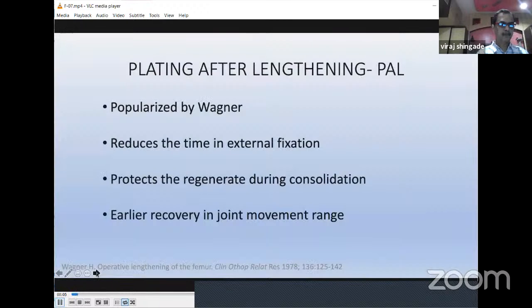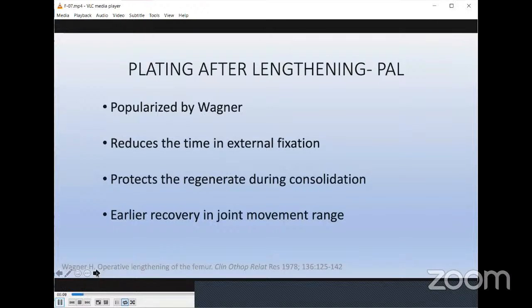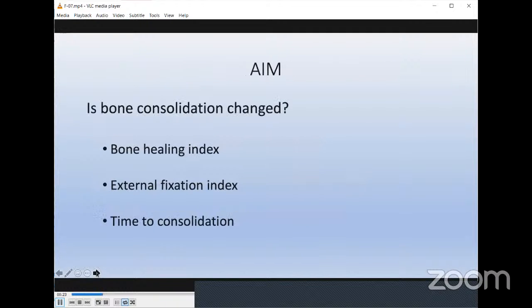The technique of plating after lengthening was popularized by Wagner in the 70s with the Wagner device. The advantages of this being to reduce the time in an external fixator while protecting the regenerate as it consolidates. Removing the fixator early helped with the range of movement as well.